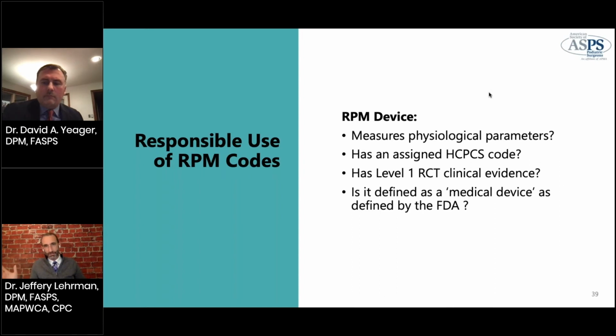And in my silly example, the pedometer that's coming out of the cereal box, that's not covered. There's no code for that, right? And you will find other examples out there as you consider your options that also are not covered and don't have HCPCS coding. And I'd suggest that that should play a role in your selection of what device you're going to use to provide this type of feedback.